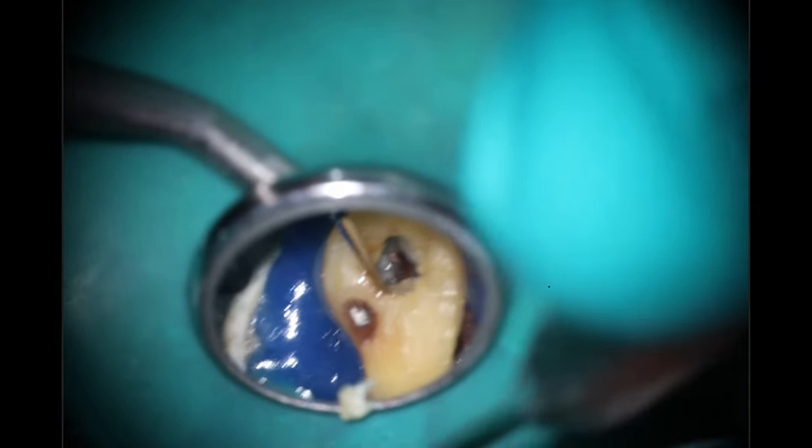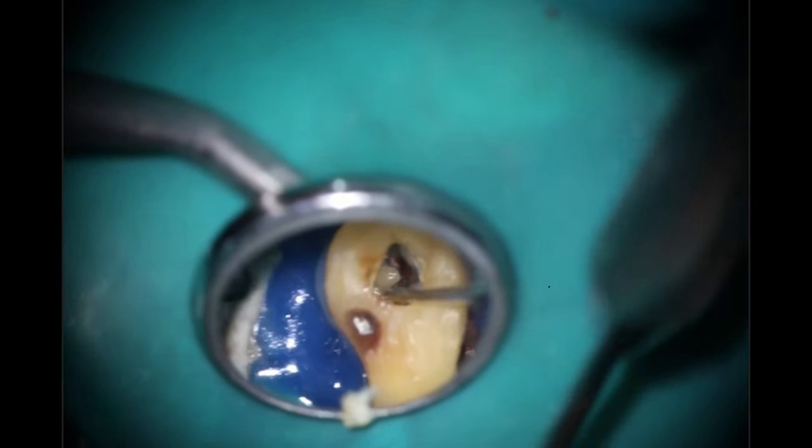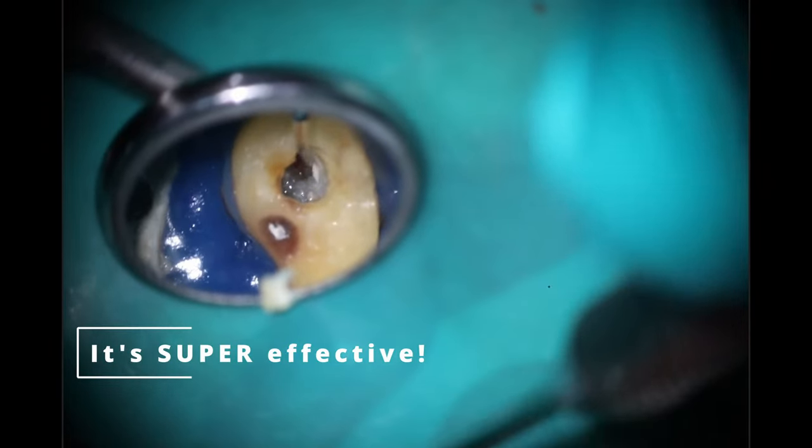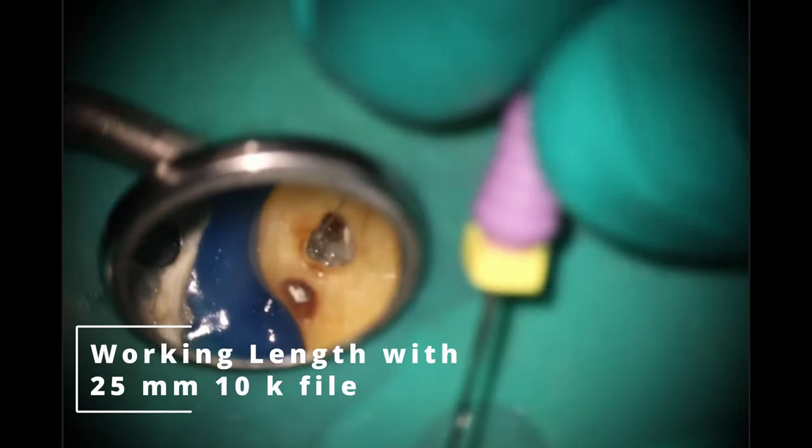And you'll see it's kind of hanging up in the chamber where I would normally do my access. If I was doing a traditional pathways-of-the-pulp access — popped it out, which is great. However, I want to conserve as much tooth structure as possible. This is the mother-in-law of one of my best referrals — we're good friends — and I want to make sure that we can save her tooth.